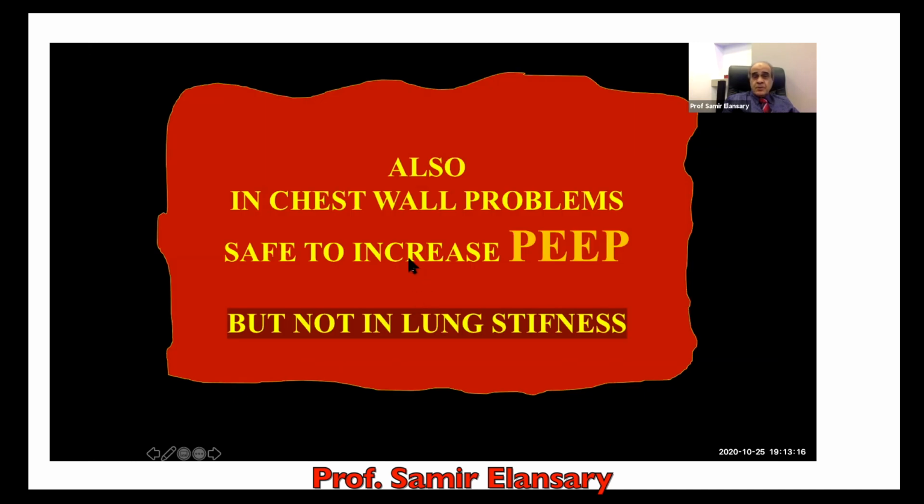Also, in chest wall problems, you can increase the PEEP, no problem, but don't increase it in lung stiffness. Don't increase PEEP in lung stiffness because it will be reflected on airway pressure and subjects the patient to barotrauma.